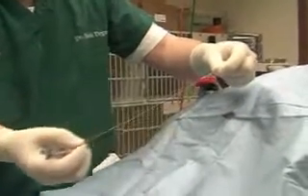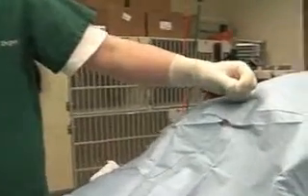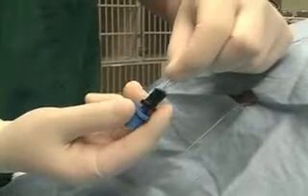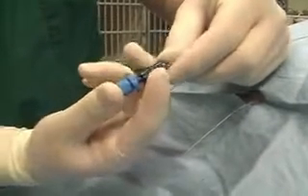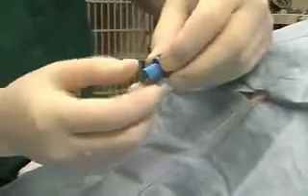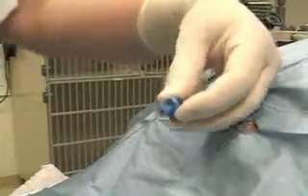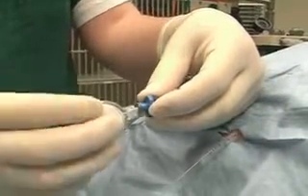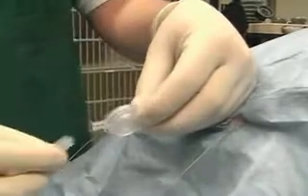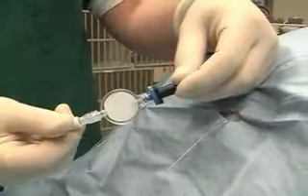This catheter has got a stylet in it. This is an adapter that goes onto the end of the epidural catheter, and we simply fix it in place by pushing the black part together onto the blue part. Then we unscrew the cap and place the filter, which is a micropore filter, and then we're going to place an injection cap onto the end of the filter.